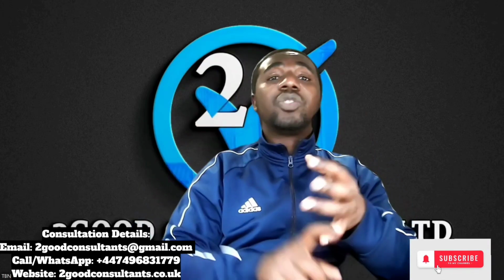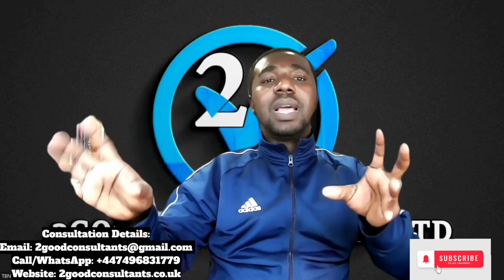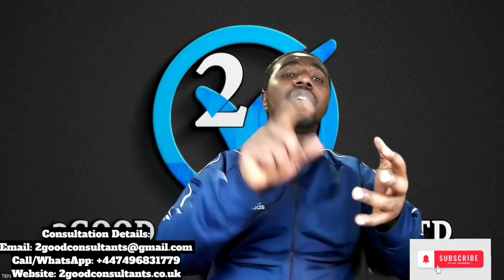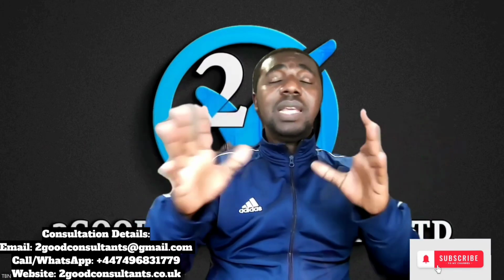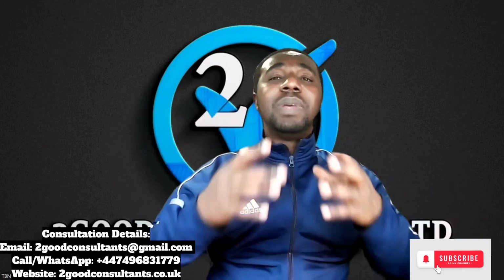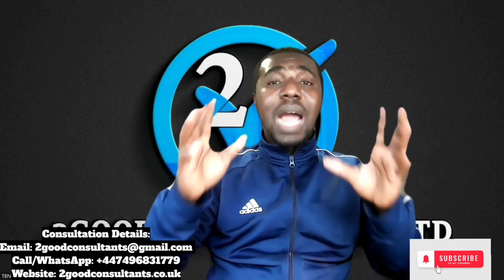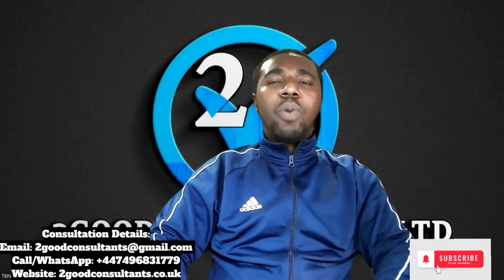So inadequate deparaffinization could contribute to poor IHC staining. So the solution is to ensure there's a proper deparaffinization, like I've mentioned, and of course double check the protocol and see where possible, if there's still weak staining, what we can amend, what the area is that we might need to change or update, as the case may be, to ensure that the process is done the way it's supposed to be done. I hope that makes sense. So don't forget, inadequate deparaffinization is one of the factors that could lead to poor IHC staining.